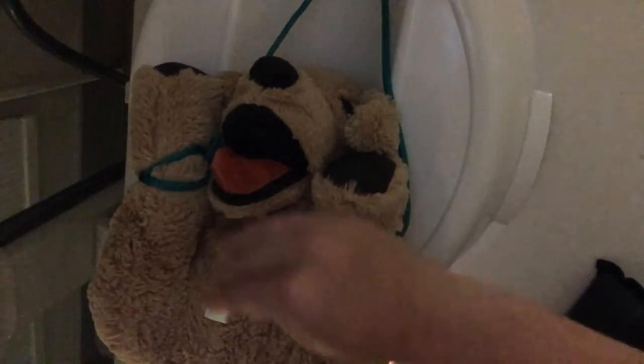For speed, to show the video, I'm just going to pull them tight. I always want to be looking from his nose down to see how we are getting on with our rotation. You would see that his rotation is not too bad at the moment — it's the camera angle that's slightly off. So I've got him roughly in position. Remember with your ties, don't go mad, and wind them several times around the cleat on the table, because if you want to change position it's going to take longer. Remember to do it gently at first, because you might need to move your patient around.